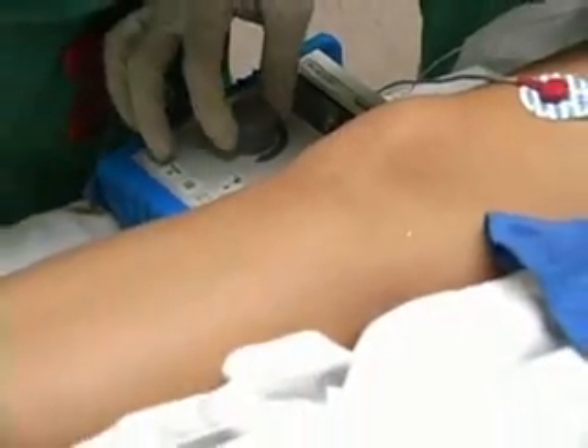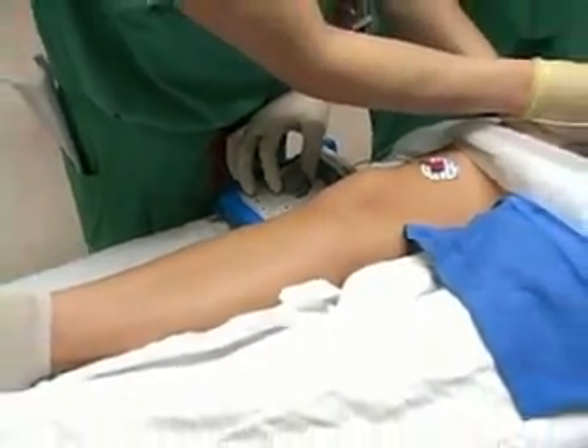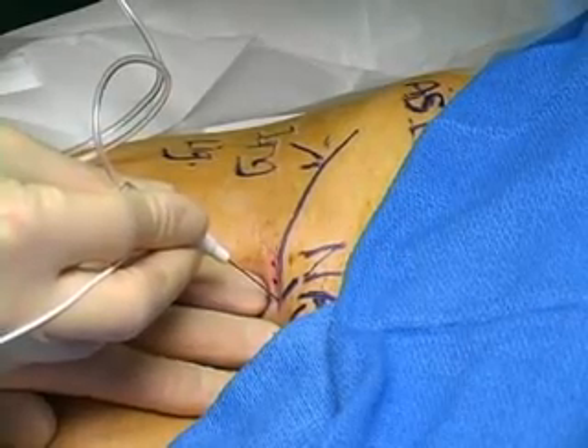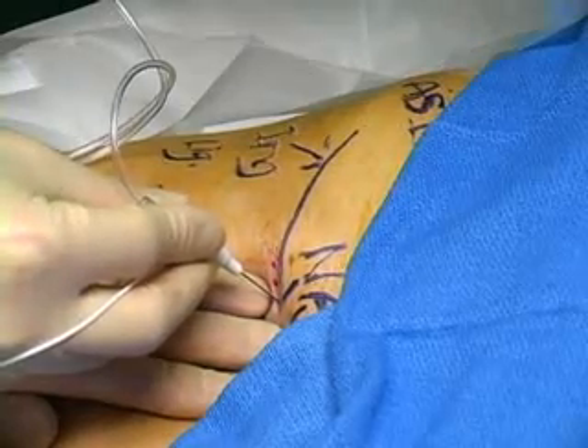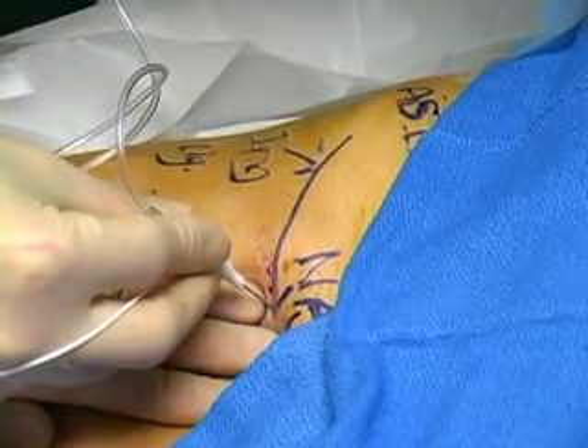After skin penetration, turn on the nerve stimulator to 1.5 milliamps. Advance the needle in the cephalic direction, maintaining it at a 45 degree angle to the skin. Continue to insert the needle through the fascia until a patellar twitch is elicited.